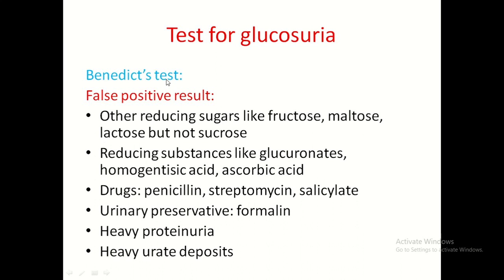A false positive result in Benedict test may be due to other reducing sugars other than glucose: fructose, maltose, and lactose — but not sucrose. Non-sugar reducing substances may also give a positive result, including glucuronates, homogentisic acid, and ascorbic acid. Some drugs also cause false positive reactions: penicillin, streptomycin, and salicylates. Urinary preservative formalin and heavy proteinuria or heavy urate deposits may also give false positive results.